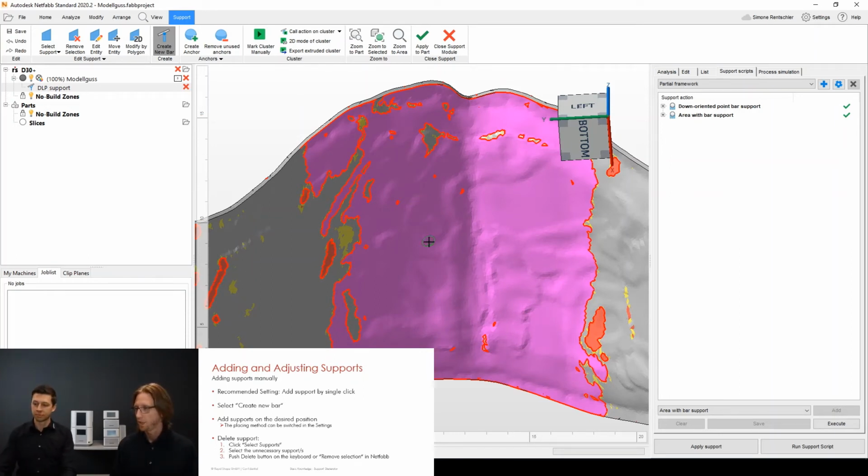Let's see if I can manage it. Well, you see this, you're struggling like I was before. This can be quite difficult to do, and it will be the same for the customer. So basically what will happen is the time I have used to perform my double click on my mouse is not quick enough, and therefore it is just creating an anchor and another anchor in the very same position, and therefore no actual support is created.